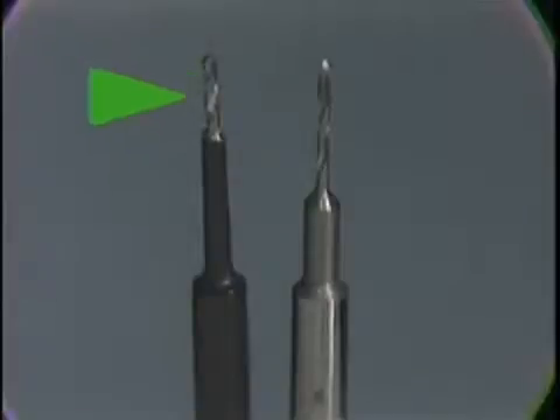TMS twist drills come in various forms. The twist drill on the left is a self-limiting twist drill — it has a collar or stop on it so that the cutting edge of the drill is only three millimeters in length, and the twist drill will only sink into the tooth three millimeters before it stops. The twist drill on the right, in contrast, has no self-limiting stop and it is five millimeters in length.